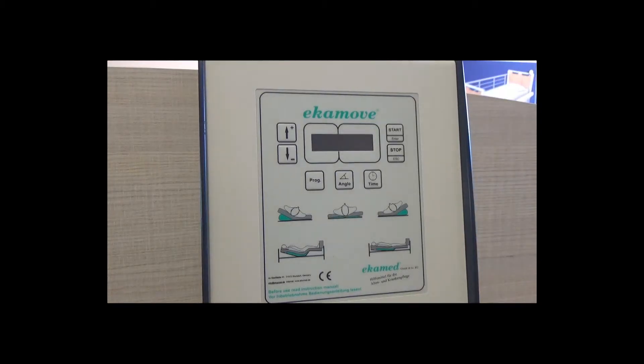The system is now set up and ready for programming. The mattress can be placed back on the bed at this point. The Ekamove should be plugged in at the mains and then turned on using the switch under the control unit.